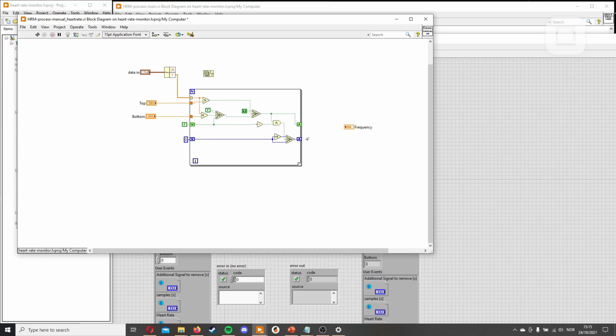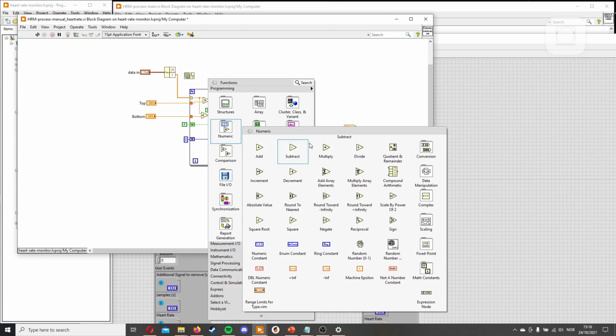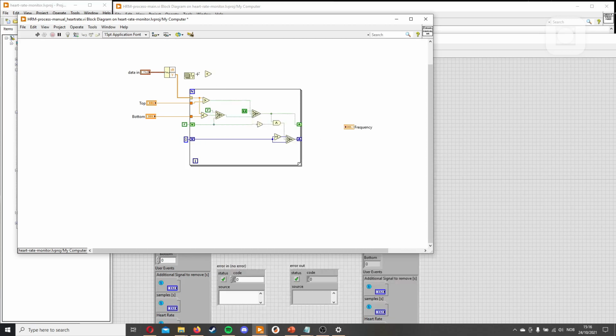But that's not enough, because if it happened 10 times over 10 seconds, it means the frequency is 1. But if it happens 10 times over 1 second, it means the frequency is 10. We need a way to calculate it from the sample size we're actually doing it over. So what we'll need to do is to multiply how many samples are here with the delta time. So what's happening here is that we will divide how many samples we are on the timing.